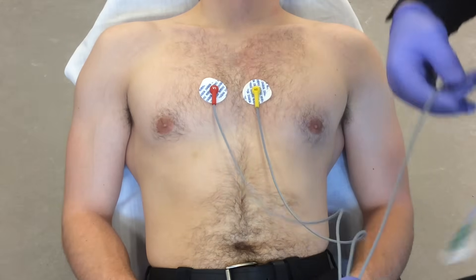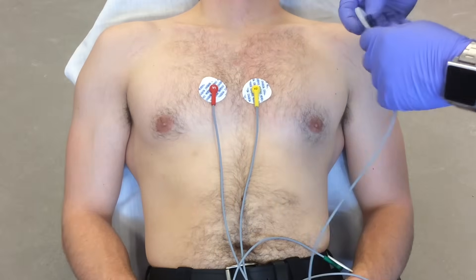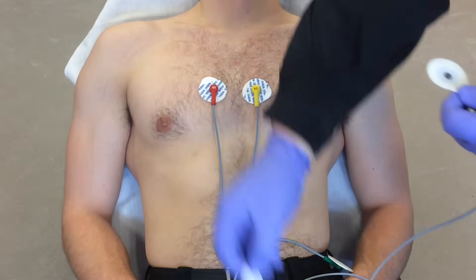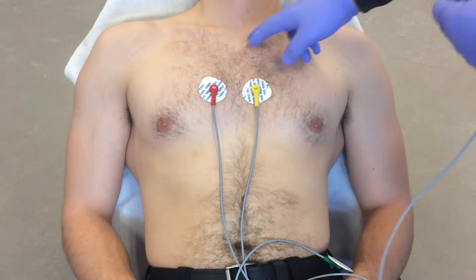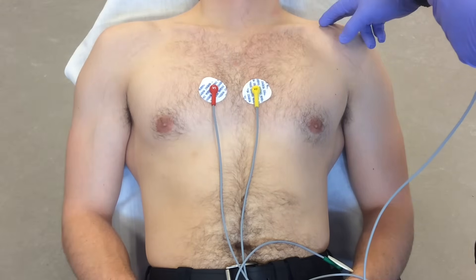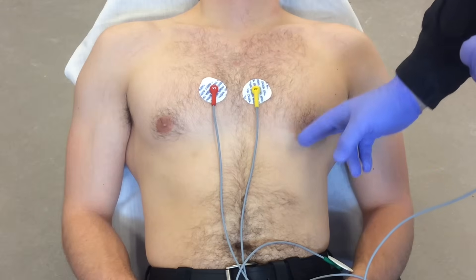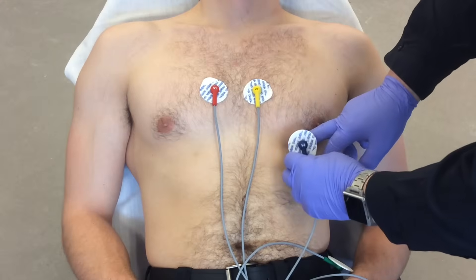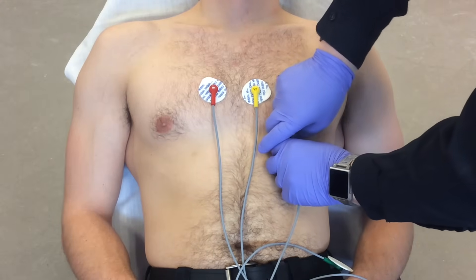We're going to put on V4 next — and I know that's out of order — but V4 goes in the fifth intercostal space at the midclavicular line. Here's the sternum, here's the tip of the clavicle, the midclavicular line is right about here. So we're going down to the fifth intercostal space right here.